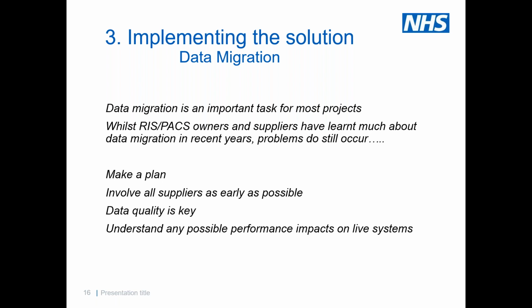So if you're planning to change systems and do data migration, my advice would be start thinking about it as soon as you can. And involve all your suppliers in that. So not just your incoming suppliers, not just those who are doing the data migration, but your incumbent suppliers, potentially your outgoing suppliers. Try and think about it as early as you can and communicate as widely as you can, because it does carry a certain amount of difficulty and challenge with it. I'll leave it at that.